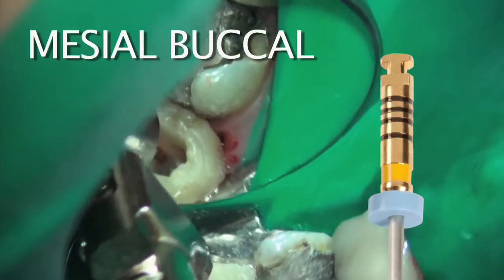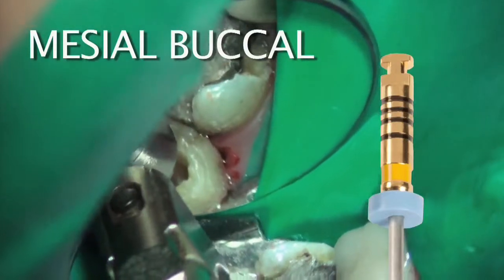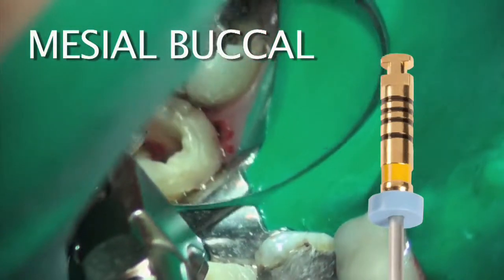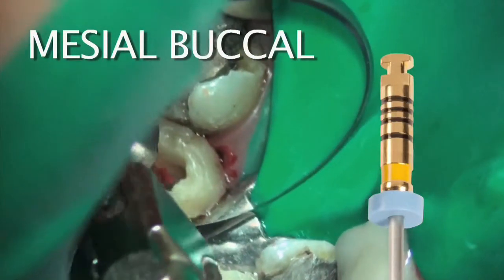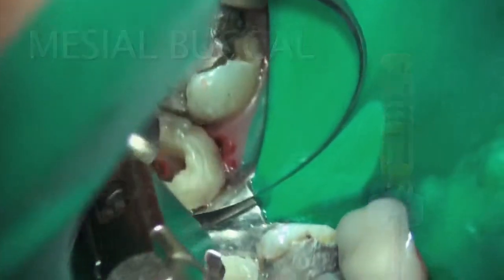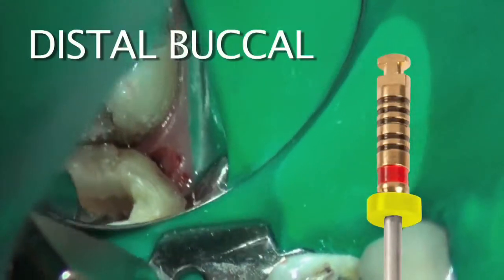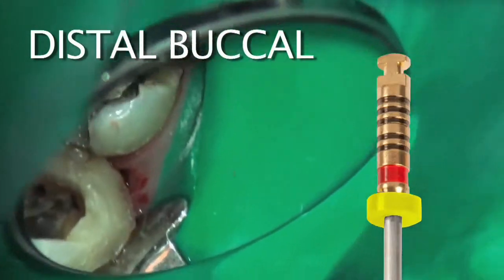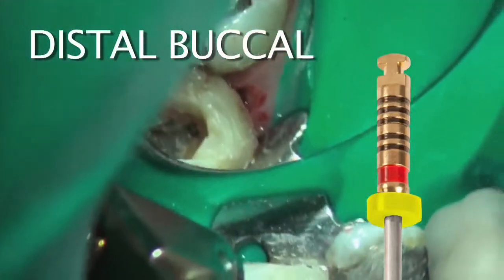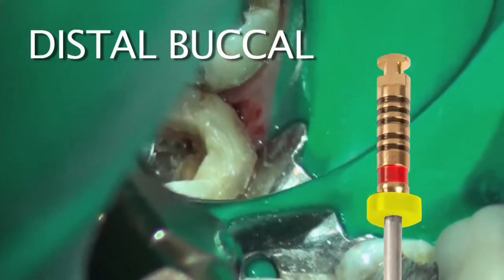I'm now in the mesial buccal orifice, and my finger pressure is going out towards the mesial buccal line angle, removing that cervical constriction — that triangle of dentin in the orifice area. This not only opens the orifice up instrumentation-wise, but it actually eases access for our rotary file system, the Vortex Blue, as we progress through the rotary file systems. Access is actually eased with these Vortex orifice openers.